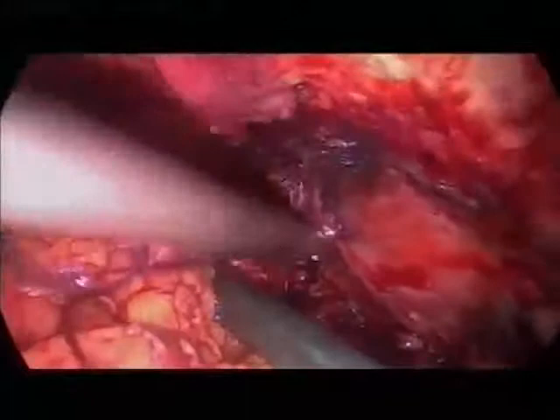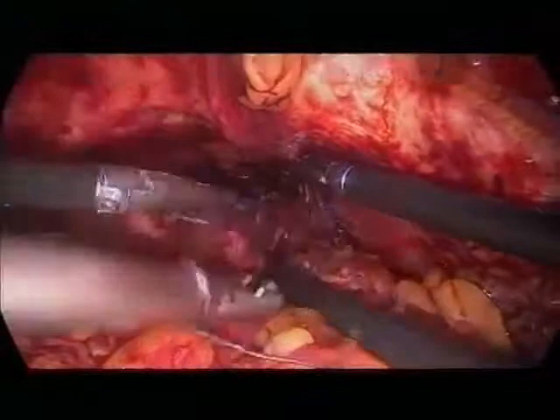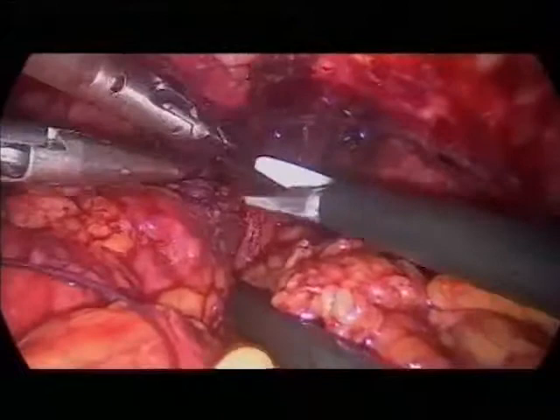What kind of needle are you using? This is a UR6 needle. It's a UR6 2-0 Vicryl. The stricture rate in our hospital, we follow up the patients for 3 years, is under 1%. So for this reason, we don't see any reason to use monofilament suture material.